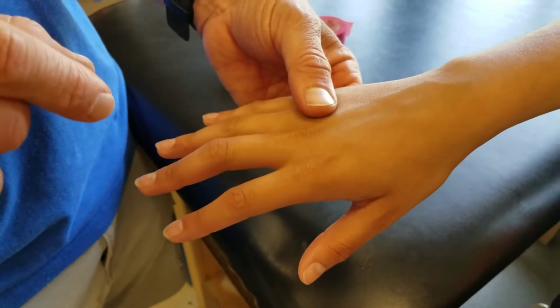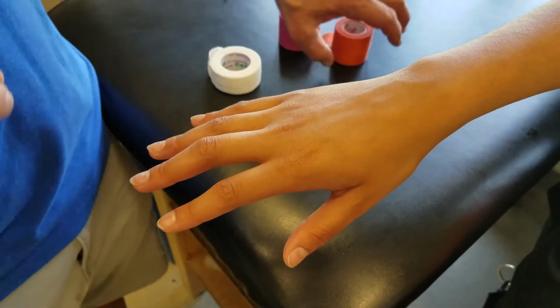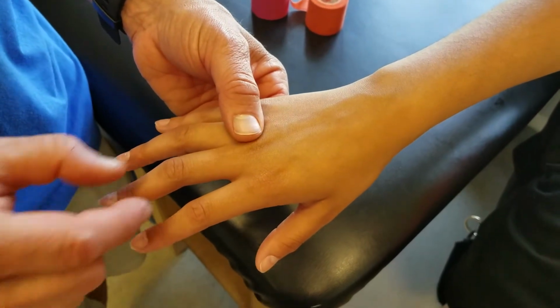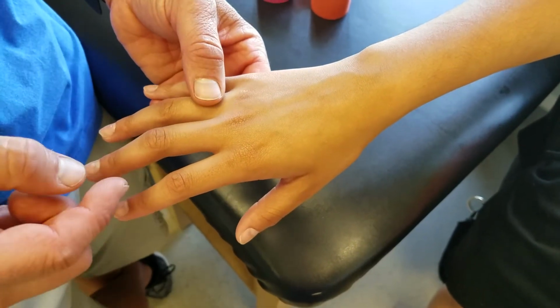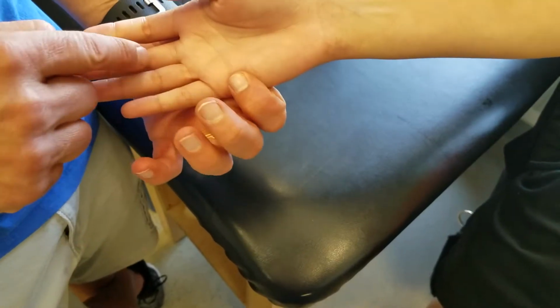All right, so we're going to do a buddy tape job, and I'm going to show you something that I use. The buddy tape job is usually used for a collateral sprain, usually at the PIP joint. Rarely do you see DIP joint injuries. And so the collaterals, or even the volar plate.